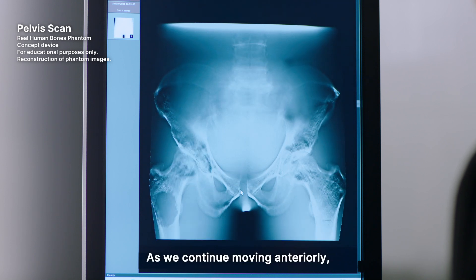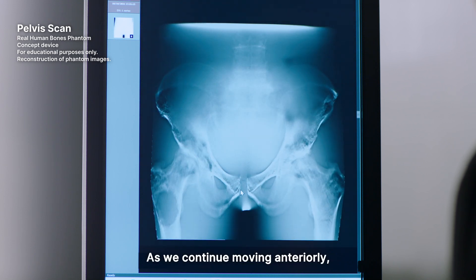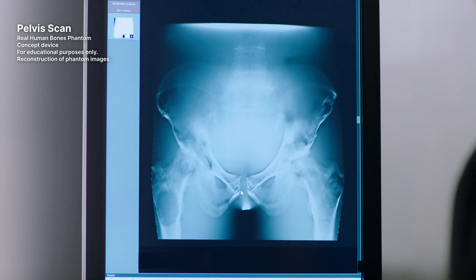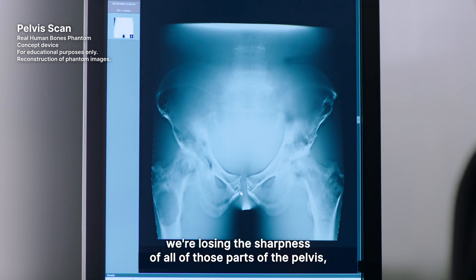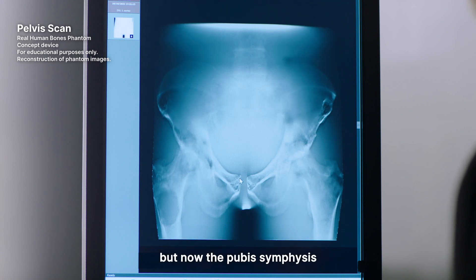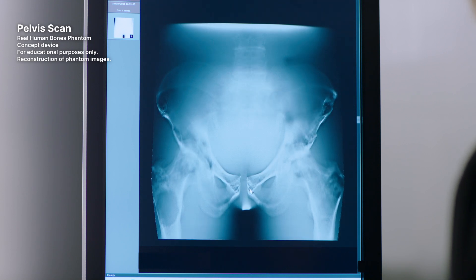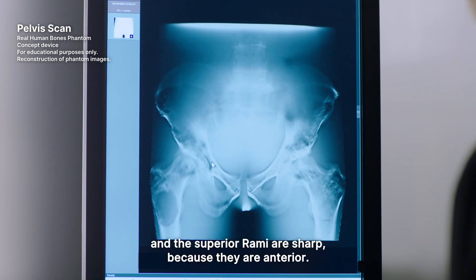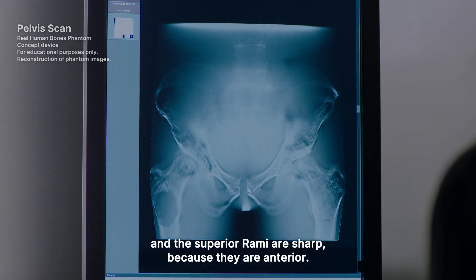As we continue moving anteriorly, we're losing the sharpness of all of those parts of the pelvis. But now the pubic symphysis and the superior rami are sharp because they are anterior.